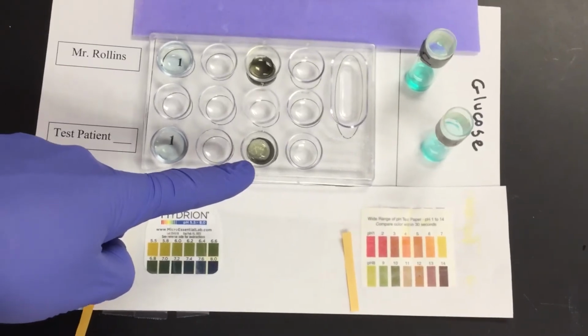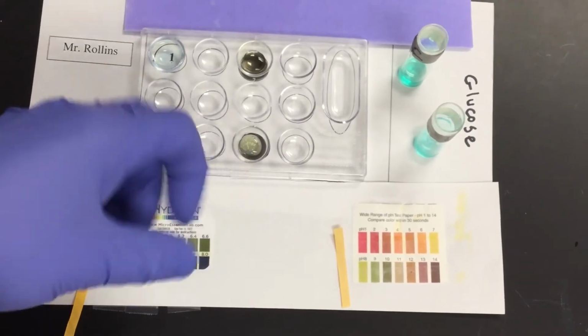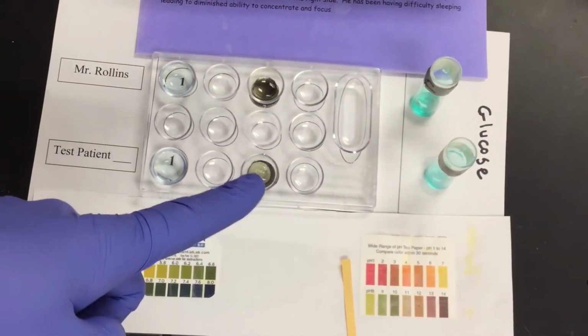But what you are going to notice is that there's a white cloudiness here. When chlorides were added to that sample of urine, we had this white, chalky, chunky precipitate form. So there's glucose, there's your protein, as well as your chloride test that you should be filling in for your chart for patient number 4.